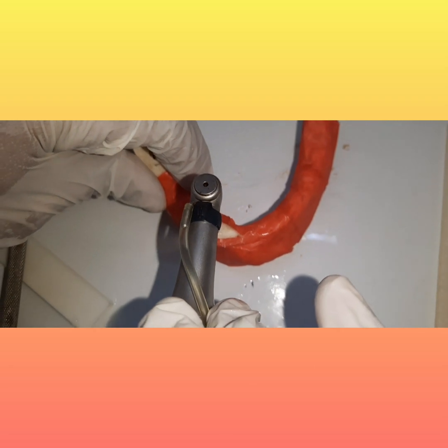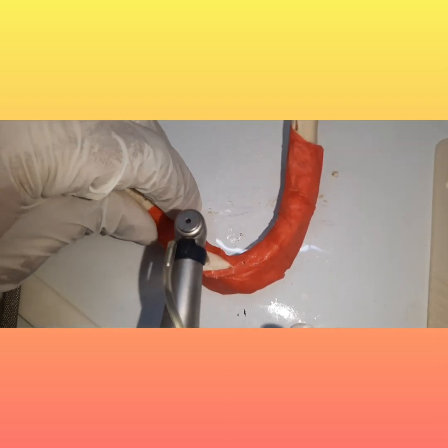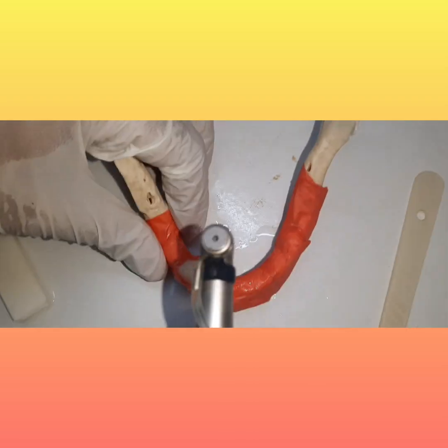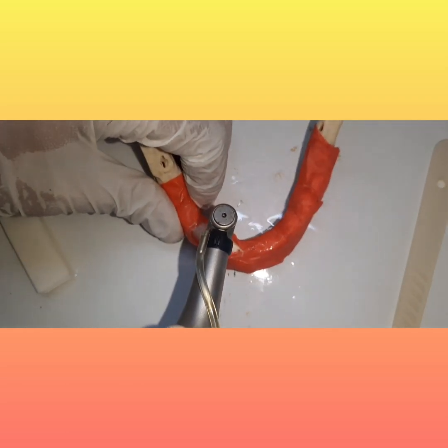So you have a drill like this. You will go in. Never apply pressure. Never apply pressure like this. Just go slow.